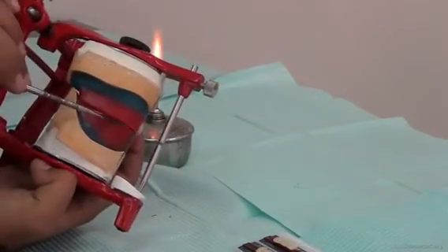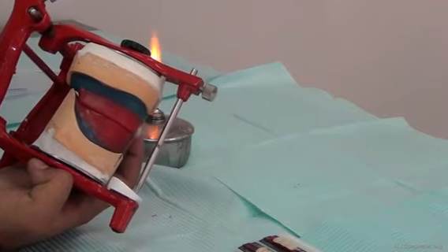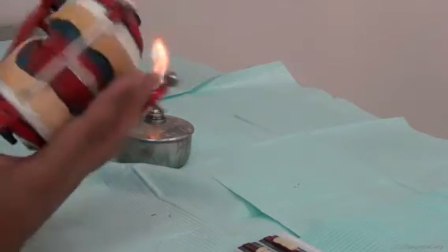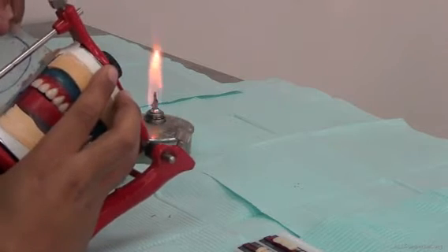Because if you had a problem with the wax touching, you will have the rules not applying. So anything we have on the glass slab in terms of tooth contact and angulations, we should have them on wax. Now we're going to check the midline.